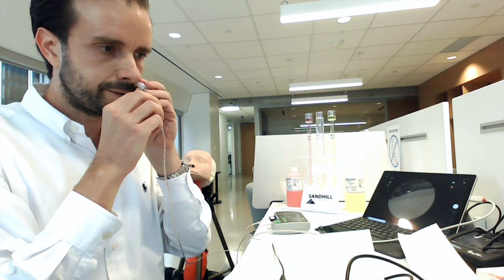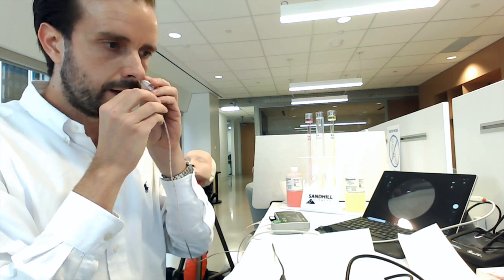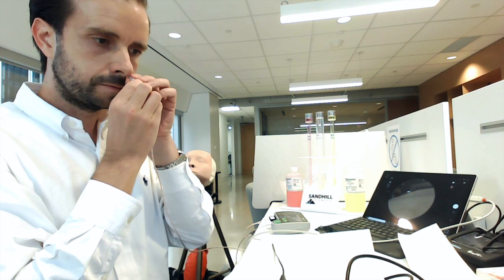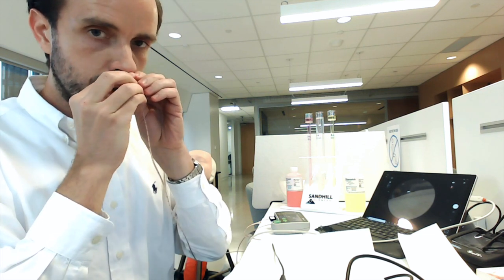So at this point, we hold the reflux probe in place and slide the introducer back. And then the introducer splits apart.